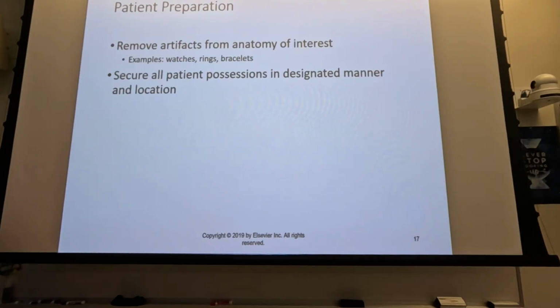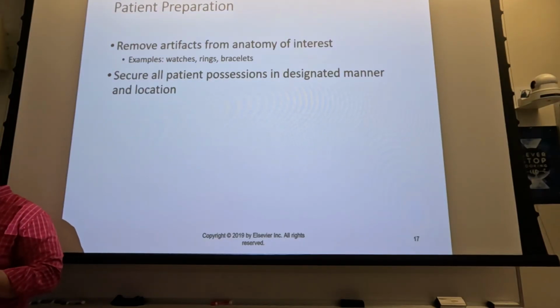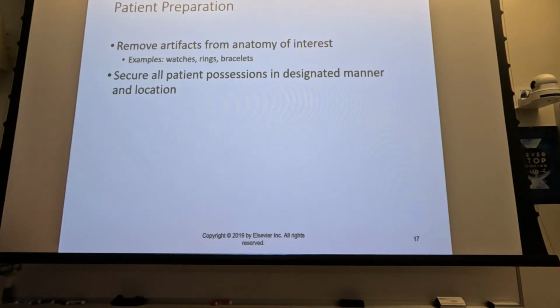So some of the gauze has metal running through it, so that if it gets potentially left inside of a patient, you take an x-ray of it, you can see it. So some will definitely show up, some might show up. The likelihood of just regular gauze interfering with diagnosis is pretty low. So if it starts spraying, cover it back up, take the x-ray.